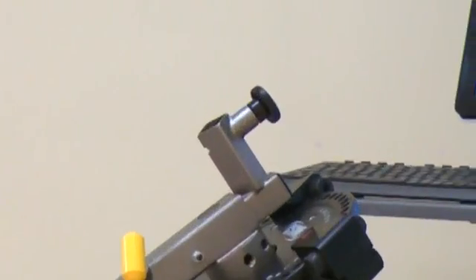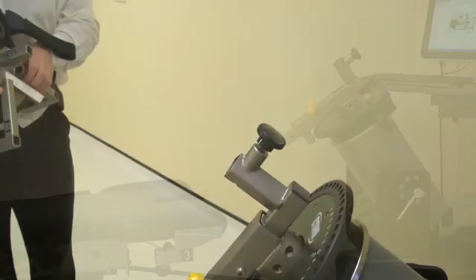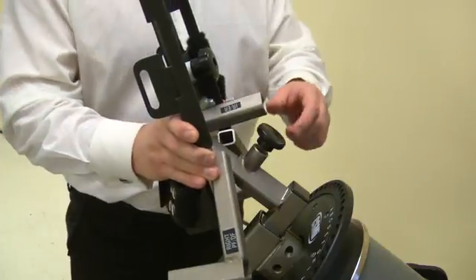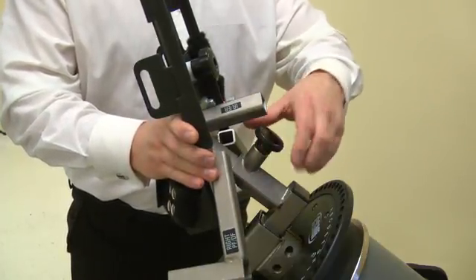Pull the locking pin to slide into place and secure using the handle. Now attach the footplate to the ankle adapter using the INV/EVR point. Slide fully into place then secure with the screw.